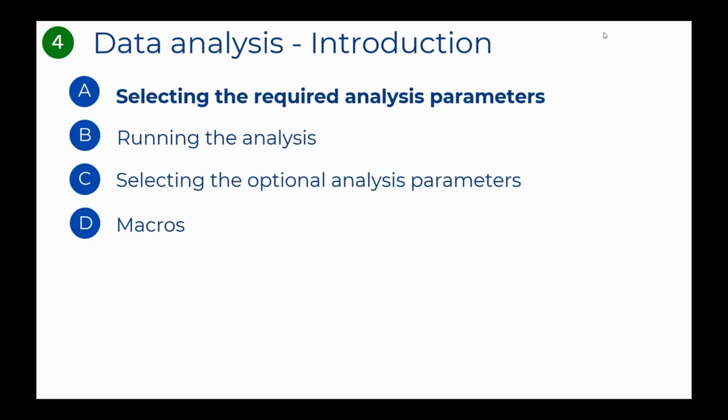Module 4. We will cover 4 topics. A. Selecting the analysis parameters required to do an analysis. B. Running the analysis. C. Selecting optional analysis parameters. And D. Macros.